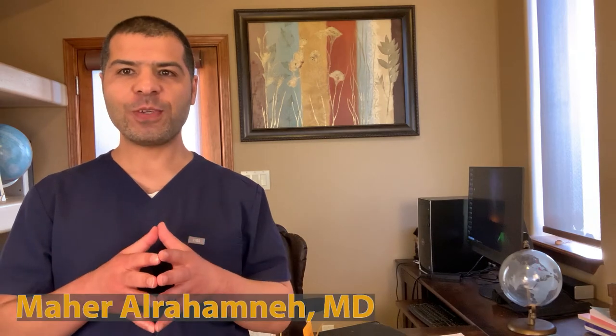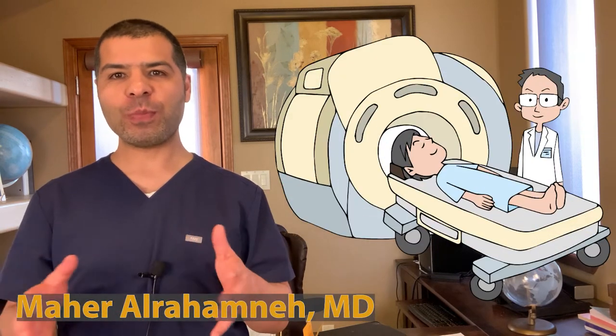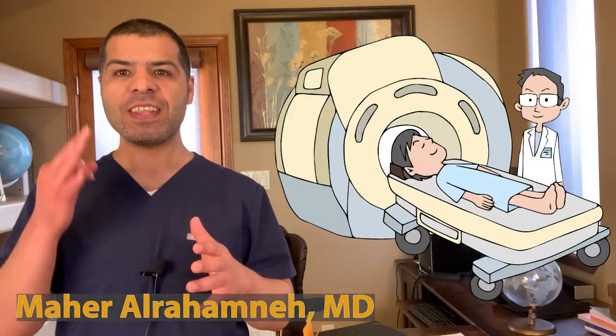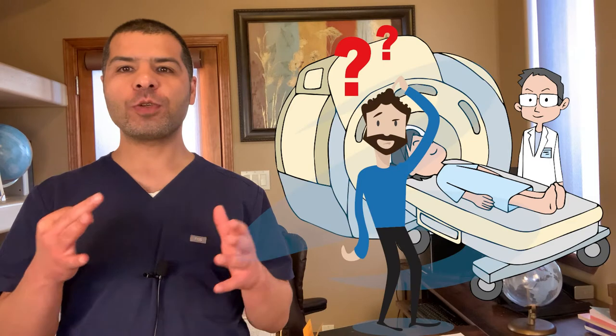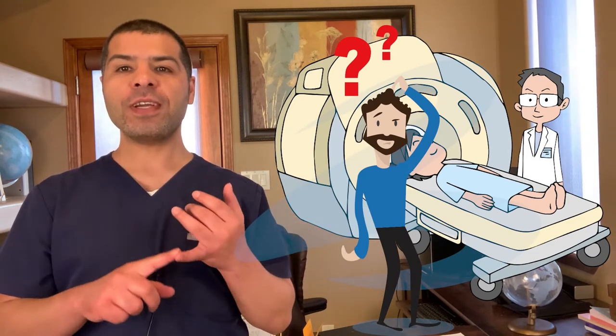Every time we order an MRI for one of our patients, three questions should pop up in our minds. First, can our patients safely undergo an MRI?